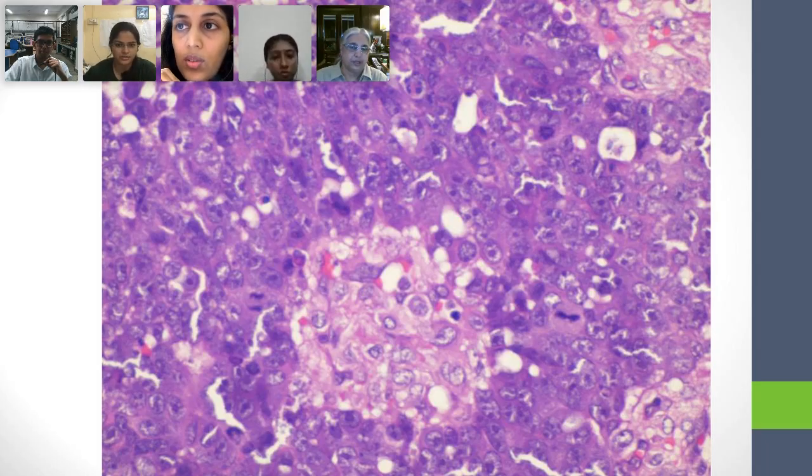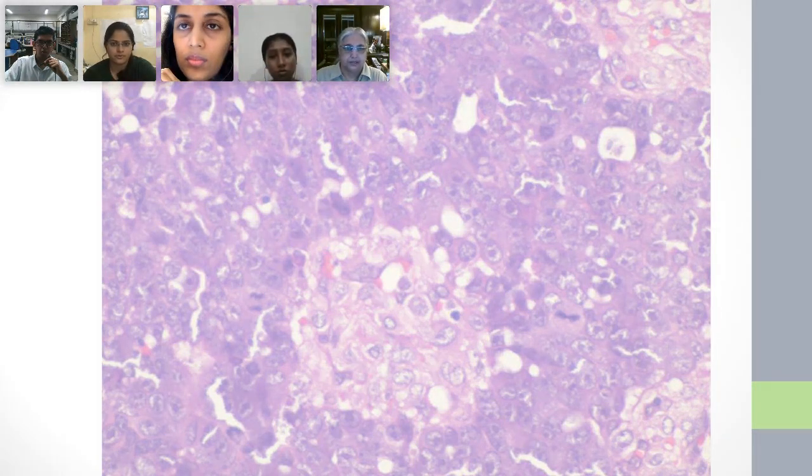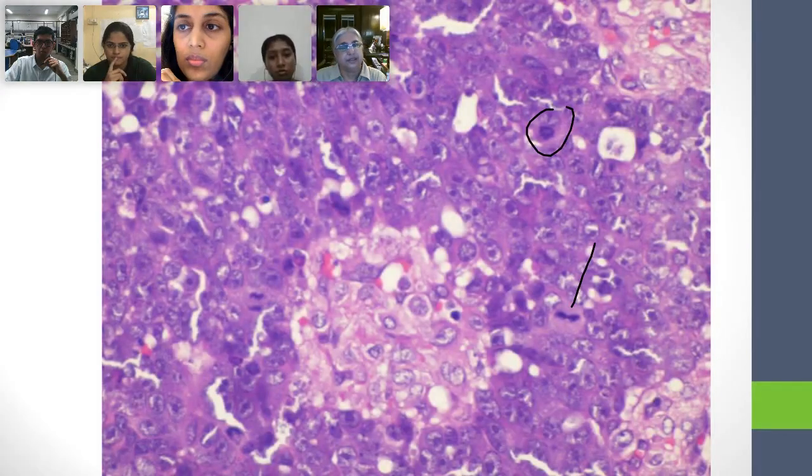Two mitotic figures. You think this is one mitotic figure here. Yes, here is a mitotic figure, right? Yes, ma'am, and you've marked a mitotic figure. Very good. How do you know that they are mitoses? The nuclear material is seen going towards the poles. So that means that the cell is getting divided. It is in the process of division. Only the nuclear material is driven towards the poles.